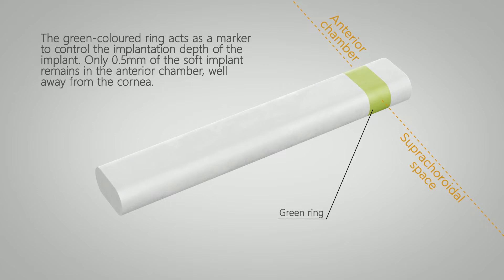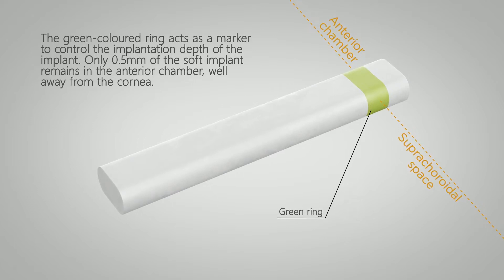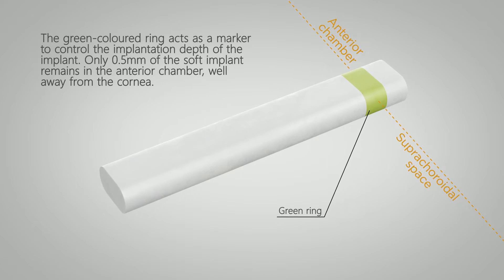The green coloured ring acts as a marker to control the implantation depth of the implant. Only 0.5mm of the soft implant remains in the anterior chamber, well away from the cornea.